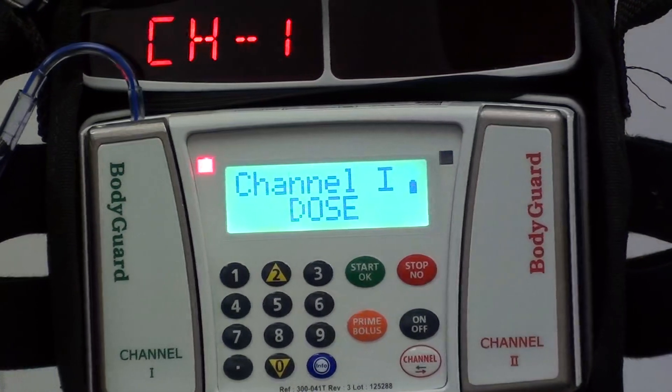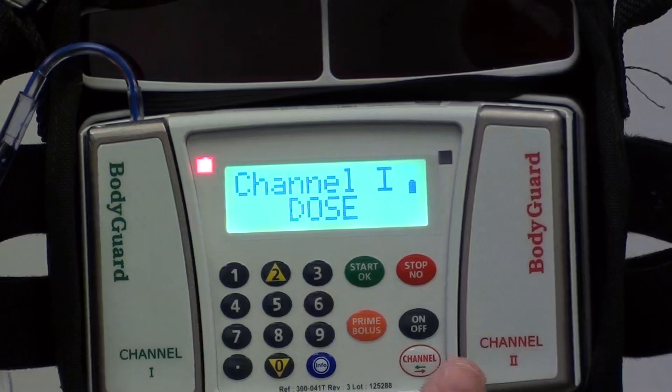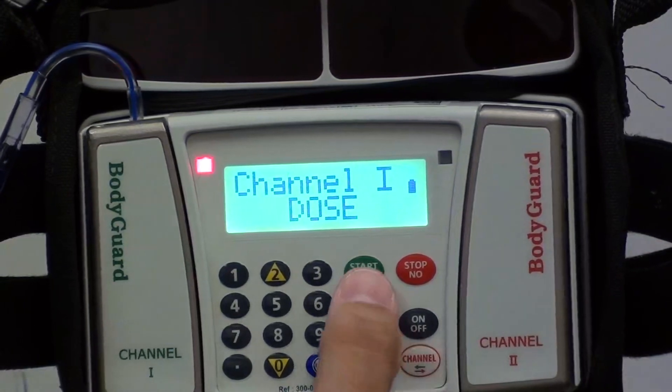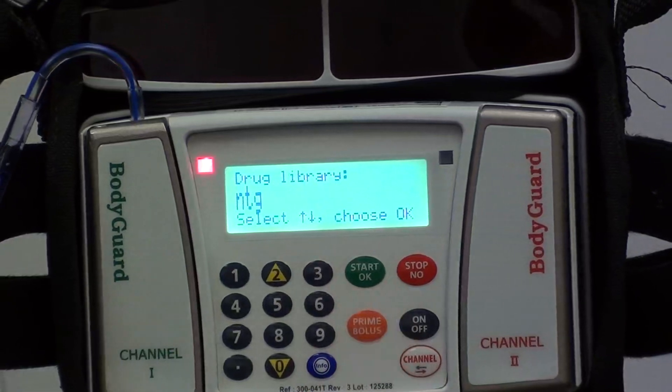It's going to bring you to the dose screen. You want to make sure that the flashing light is on the channel that you are intending to use. If it isn't, there's a channel button right here that you can toggle back and forth. At this point we're going to hit OK and it'll bring you to the drug library.